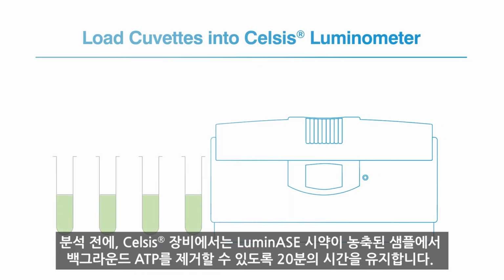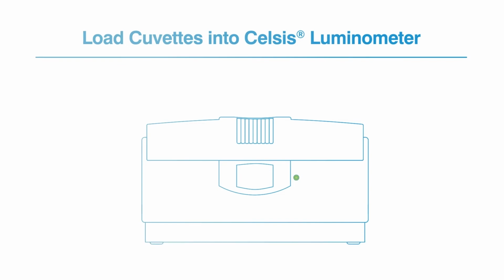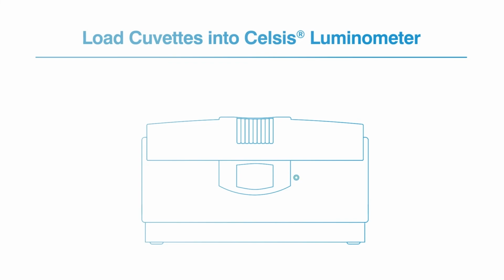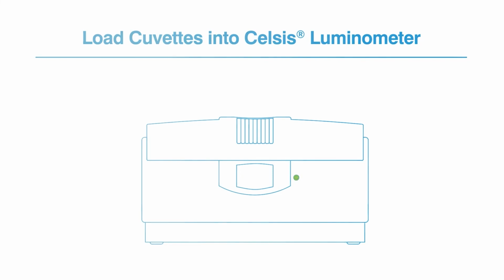Prior to analysis, a 20-minute dwell time on the instrument allows the Celsis luminase to deplete background ATP in the concentrated sample. This step, along with the subsequent ATP bioluminescence reaction, is all carried out through onboard automation. Once the analysis is completed, results are reported as presence or absence of contamination.